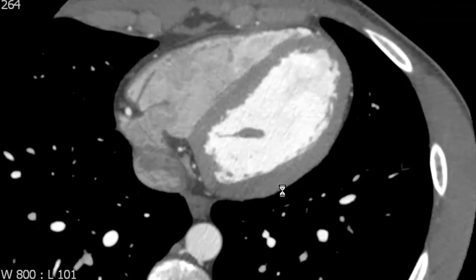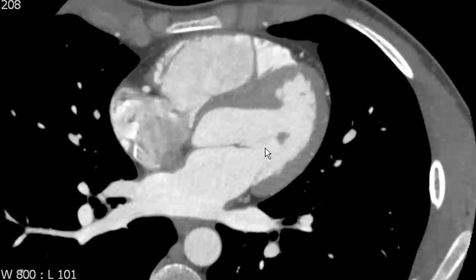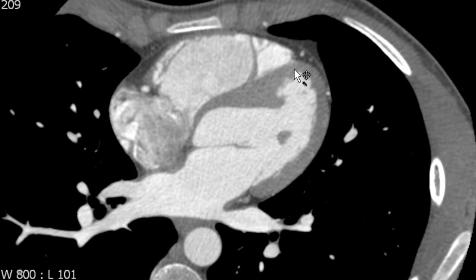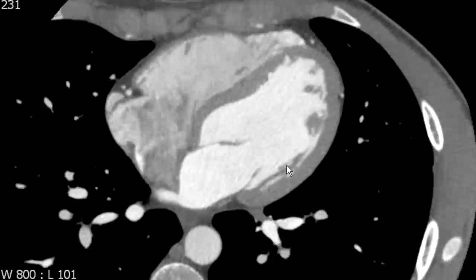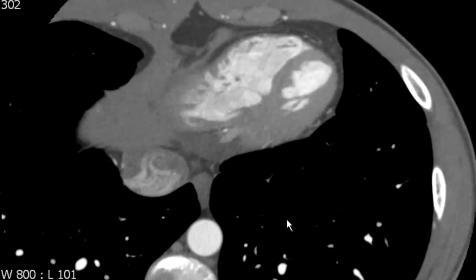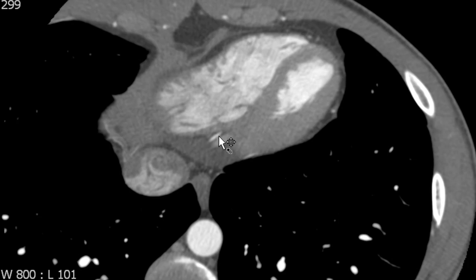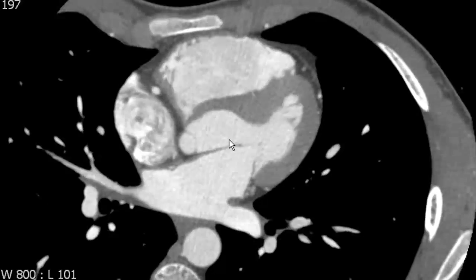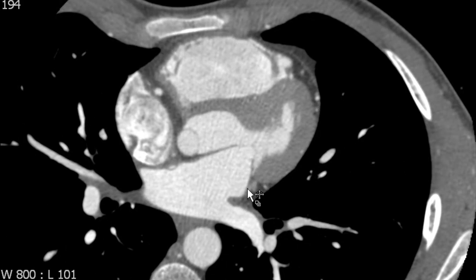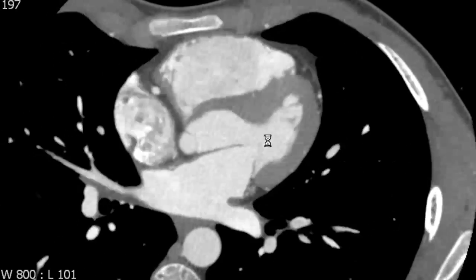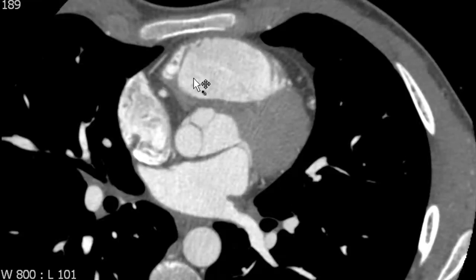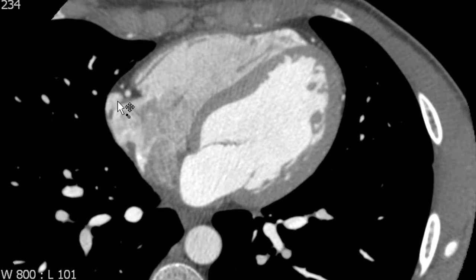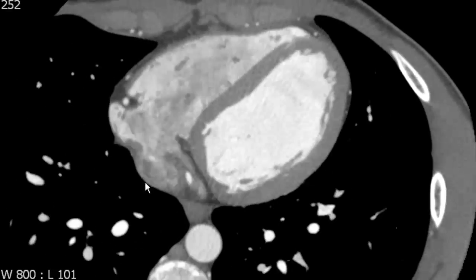So we have an anterior interventricular sulcus, which is the home of the left anterior descending artery. We have an inferior interventricular sulcus, which is the home of the posterior descending artery. We have a left atrioventricular sulcus, which is the home of the left circumflex artery, and we have a right AV sulcus, which is the home of the right coronary artery.